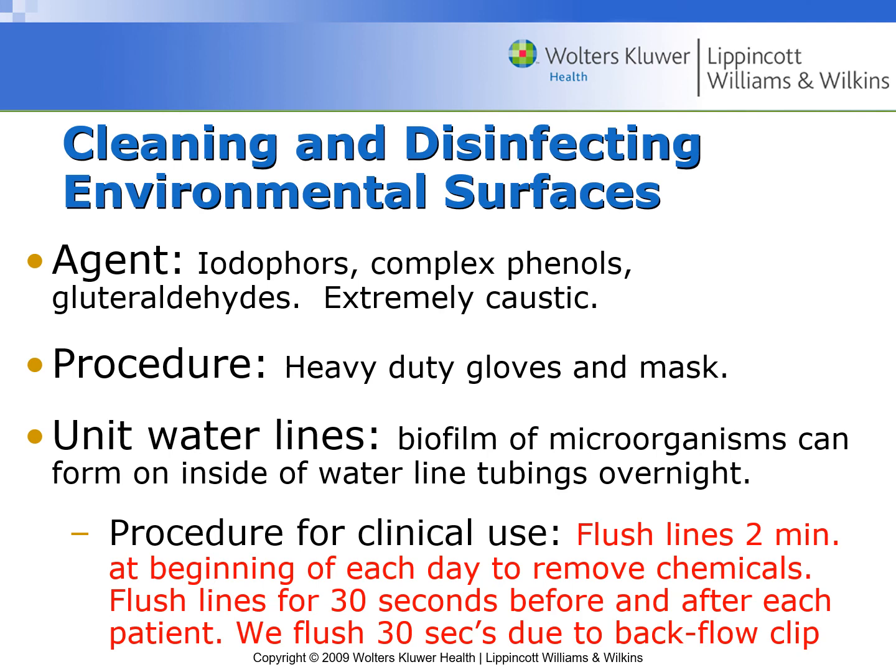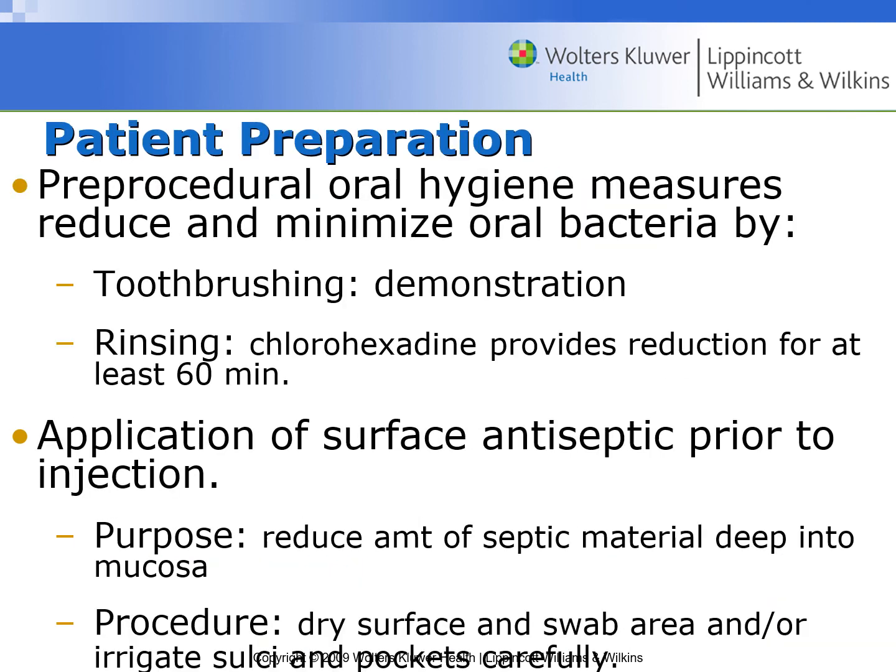Okay, I'm not sure which boards will do this. Hopefully they won't ask this type of question. I know you may have some review books when you're studying for boards that will talk about this, because on boards, you could get a different answer depending on if you have a backflow clip. But you need to know the difference of what we do and what you do when you don't have one of those.